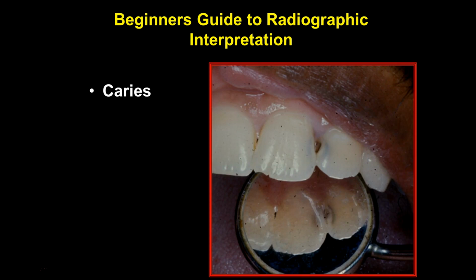As you progress through preclinic and clinic, you'll learn to use transillumination very effectively. Sometimes we don't always have radiographs for the anterior region that are current, whereas the teeth are so thin in these areas that you can shine light by transmitting your overhead light, bouncing it off the mirror face, projecting it through the teeth, and it will show you a lesion.